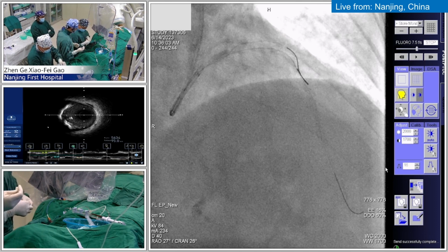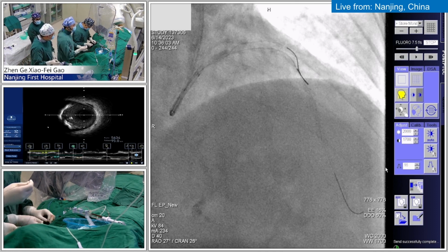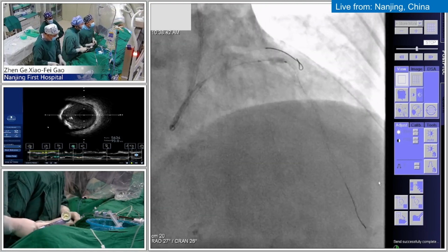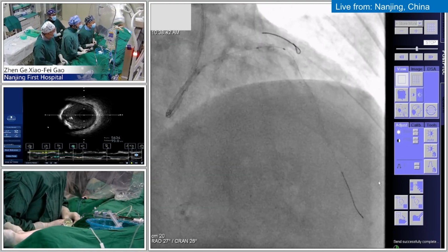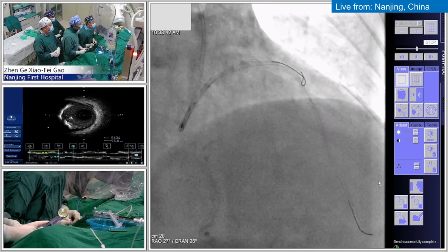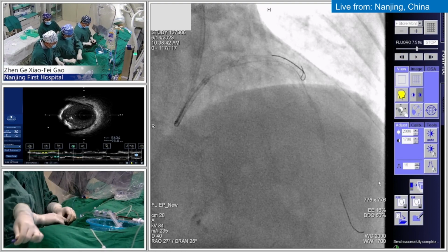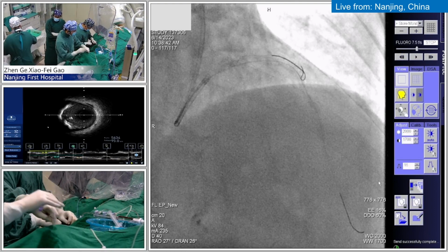With the high pressure balloon, we made much progress. Now we'll be approaching the left main. In the meantime, you're seeing the further expansion of the proximal LAD, the ostium, and the distal left main, as we continue to make progress with the wiring of the left circumflex.